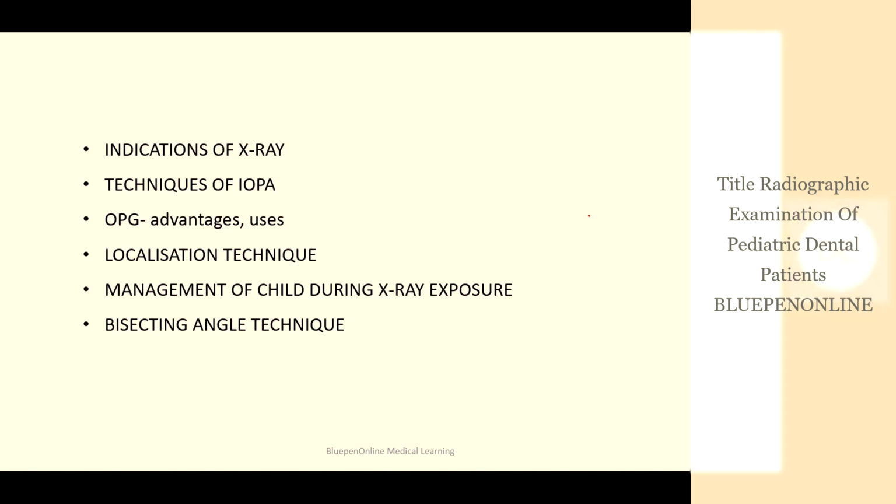Then the techniques of IOPA is another commonly asked question. The techniques of IOPA include paralleling technique, bisecting angle technique, then uses of OPG or orthopantomogram or panoramic radiograph, then localization technique or the Clark's technique or the right angle technique.